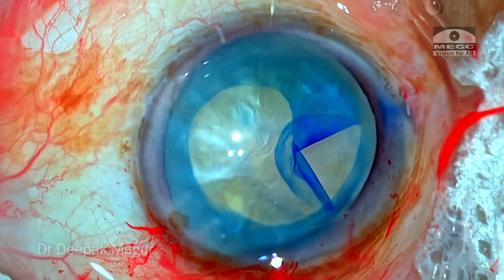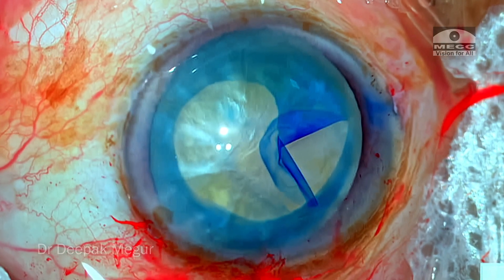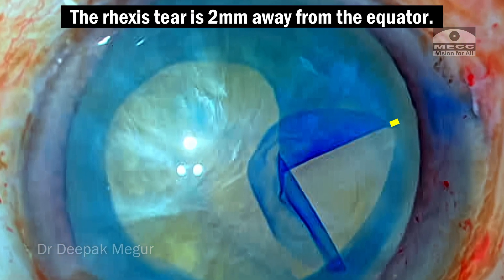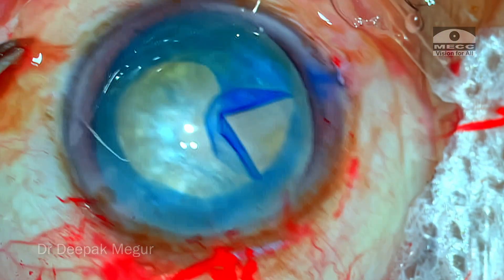Let's see whether the surgeon is successful in retrieving back the rhexis. At this point it's very much possible to retrieve it — the rhexis tear is still about 2 mm away from the equator. It's very easy to retrieve it back, provided we use the right technique.